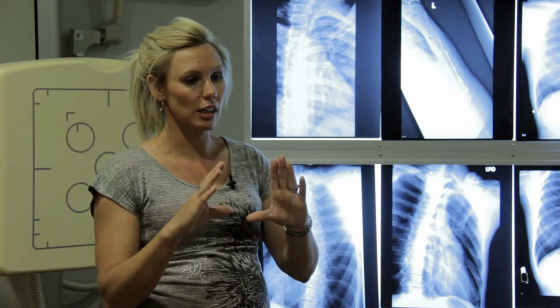Keep that KV lower and just adjust your mass, and that might help take that factor off a little bit. I mean, 72 inches is quite a bit of distance, but it will also help when you're collimating. You're using a lot less of that beam, so try to get creative a little bit. Ribs, you shouldn't really be having to shoot all that hot. And really the big part that you're trying to penetrate is the abdomen, that's when they're laying down anyway. You're maybe at 46, 50, maybe 60 inches, and a lot of that tissue now is spread out. So that should help a little bit with that concern too.